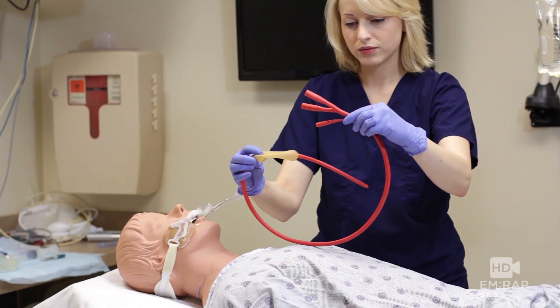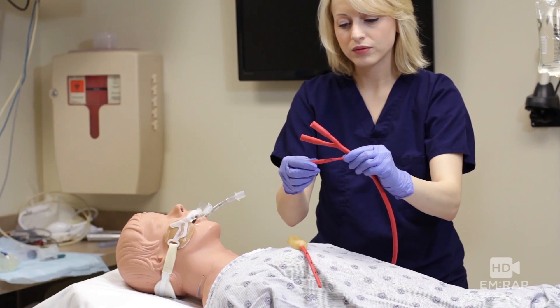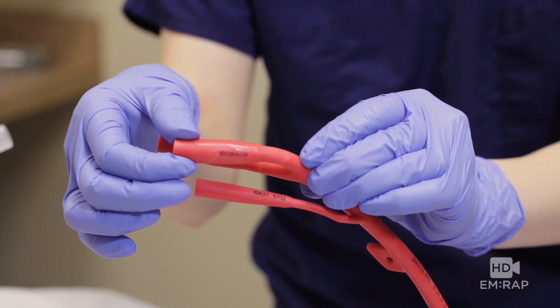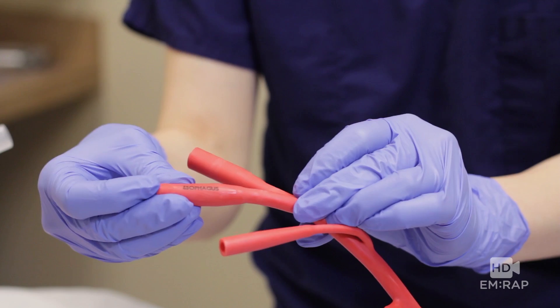Let's talk about the deceivingly simple Linton tube. Three tubes coming out of one tube — very simple. Luckily they've labeled them. This one called 'gas ball' inflates the gastric balloon. This one suctions out the stomach. And the third one, creatively named 'esophagus,' suctions out the esophagus. Brilliant.